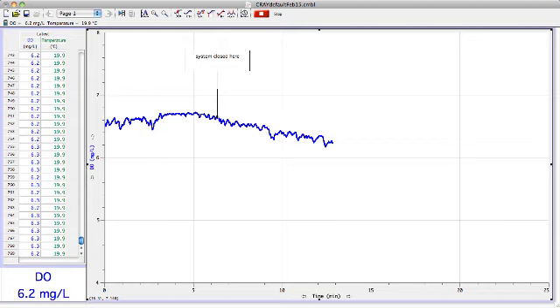So I think we're getting near the point where taking the slope is meaningful. We have enough duration and enough confidence that that is a nice downhill slope. So I'm going to let it go about 1 minute, and then we'll stop the graph and see how you get a slope. The slope, of course, is going to be proportional to the rate.